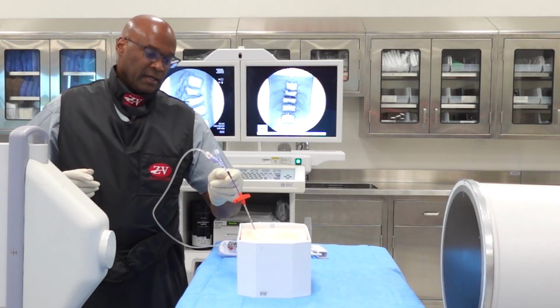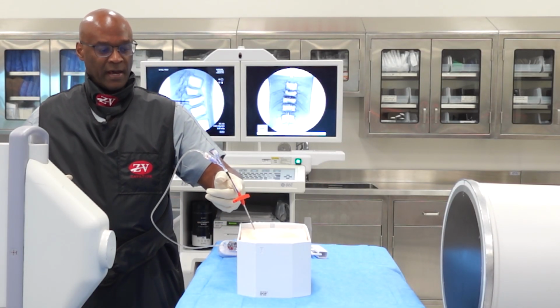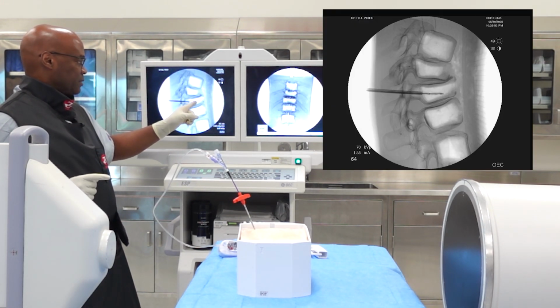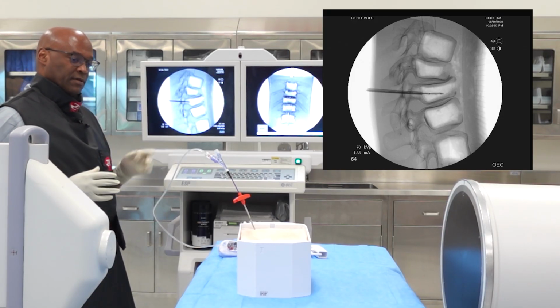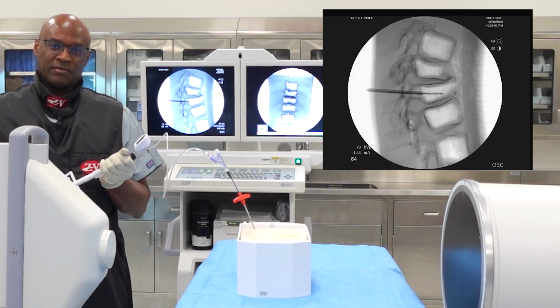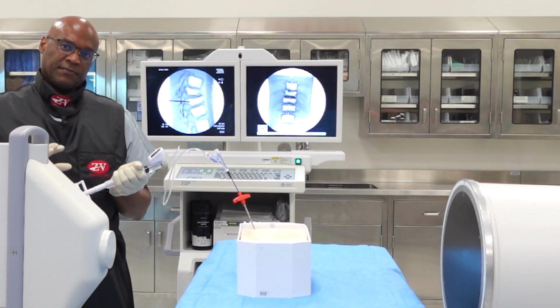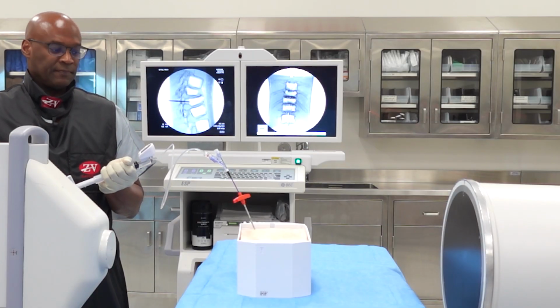So as you can see, at this point, the laser line is at the tip. It may be difficult to see from that distance, but more importantly, you can see the 2 radio-opaque beads, one distal and one proximal, that are both past the edge of the jamshidi needle. We have the inflation system prepared, which has a gauge for pressure reading as we inflate the balloon. We want to keep it in a safe region, which is between 150 to 250 psi.